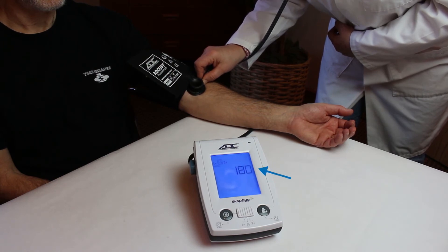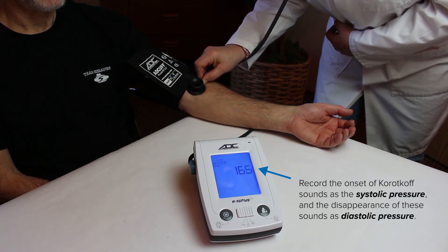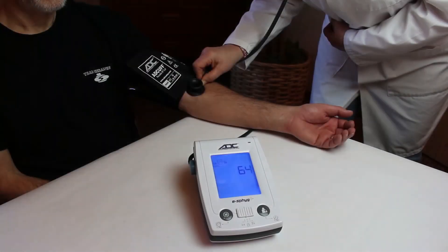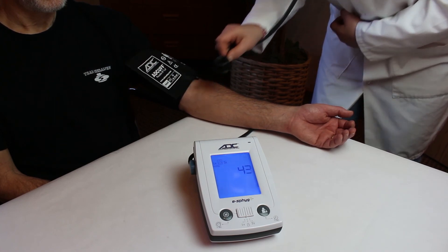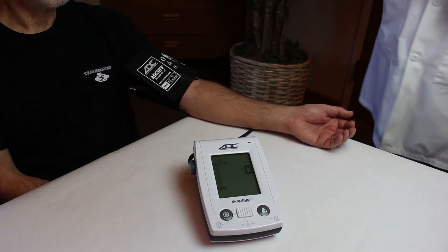When the cuff reaches maximum pressure, deflation will begin automatically and you can begin auscultation. Take note of the systolic and diastolic values as if you were measuring with a sphygmomanometer. When the cuff deflates to 20mm of mercury, the remaining pressure will vent automatically and the unit will enter standby mode. You can push the start-stop button at any time during deflation to vent and enter standby mode.